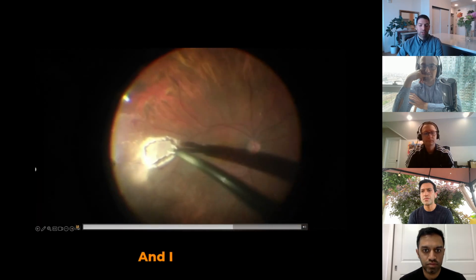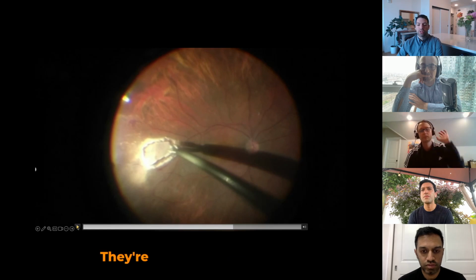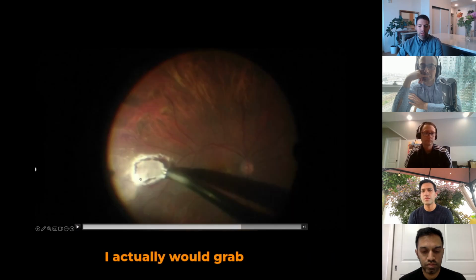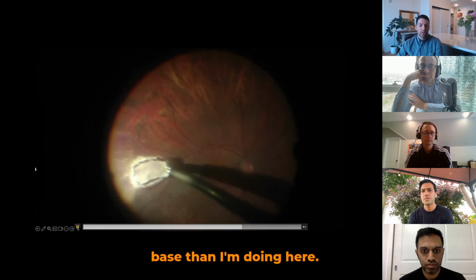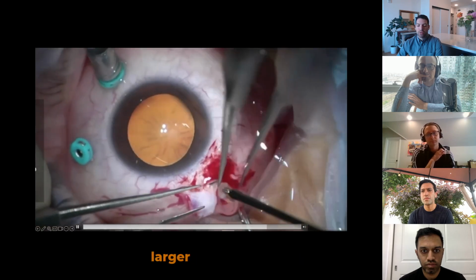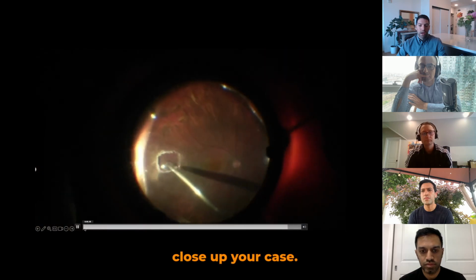And I enlarge my sclerotomy. And I think these are 20 gauge duet forceps. They're pretty large, but you can use any serrated or even max grip forceps if you want. I actually would grab more towards the base than I'm doing here. I get a little bit of traction, but I get the lesion and then you can pull it out. You want to make sure your wound was larger than you intended. It comes out nicely. And then you can send that and kind of close up your case.